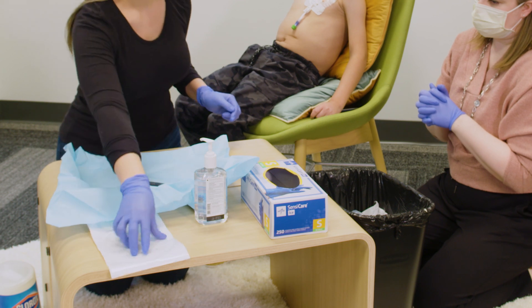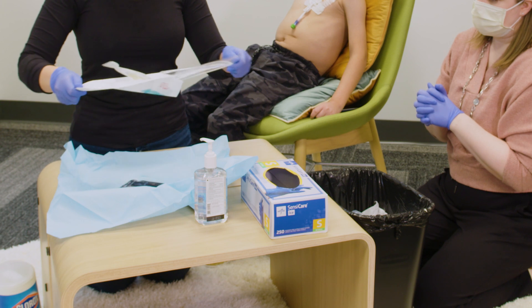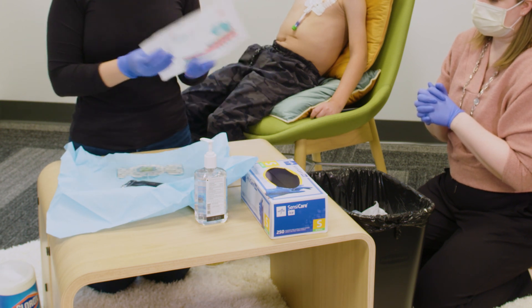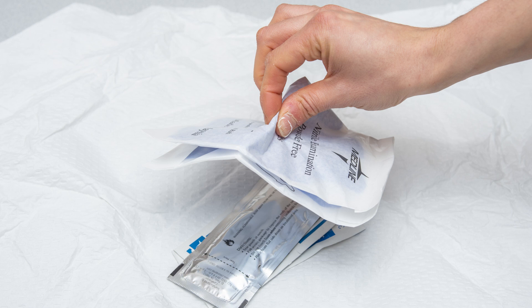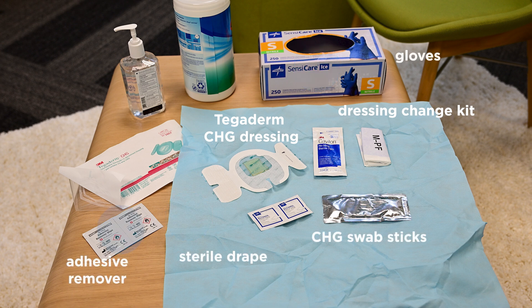Open and drop the sterile dressing into the center of the kit. Carefully grab the packet of sterile gloves out of the kit without touching anything else, and set the sterile glove packet aside for later. After you have the dressing change kit and the Tegaderm CHG dressing, gather your other supplies: sterile drape, gloves, CHG swab stick, adhesive remover, hand sanitizer, and a pen to mark the date on the dressing.